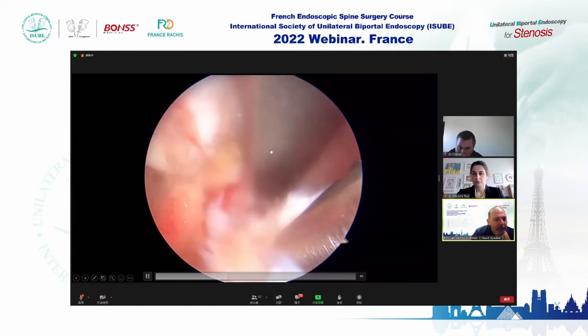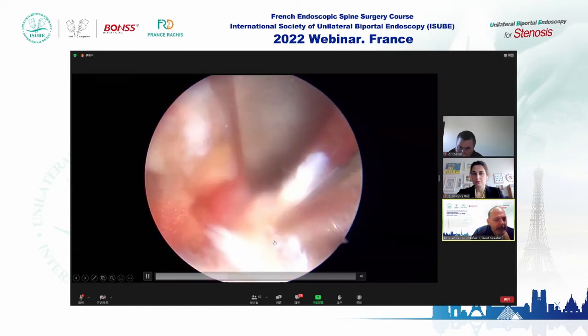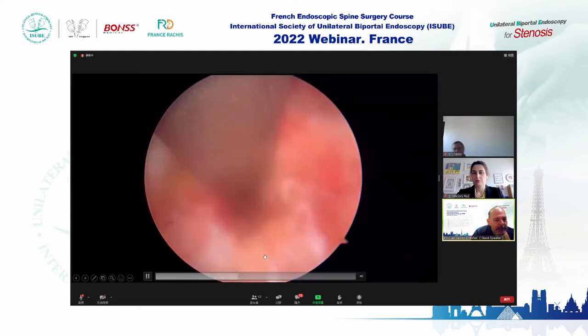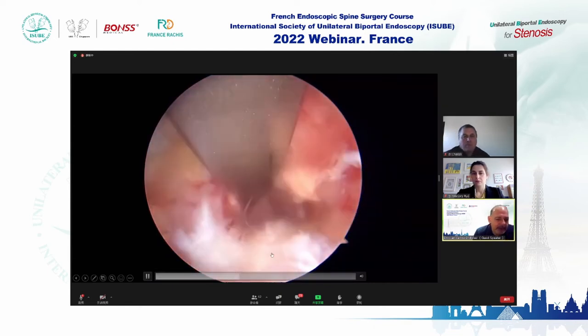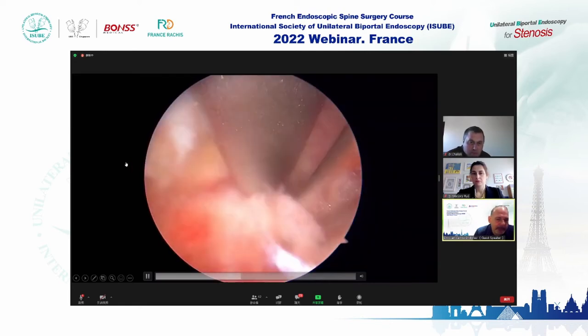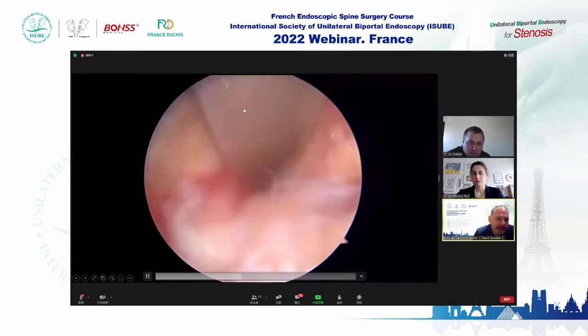Here we are protecting the dura and removing the disk — the right side of the disk. The disk is severely prolapsed toward the midline.